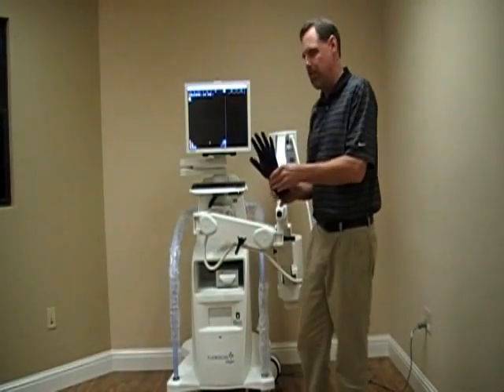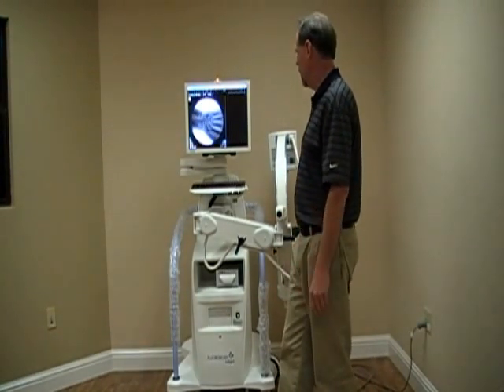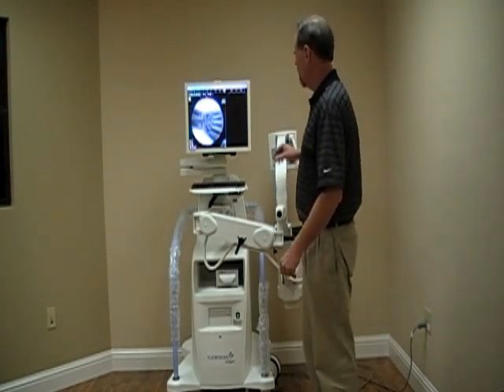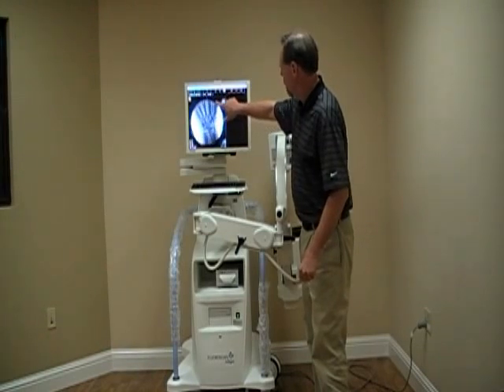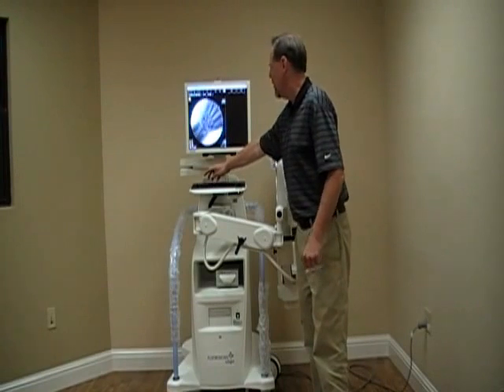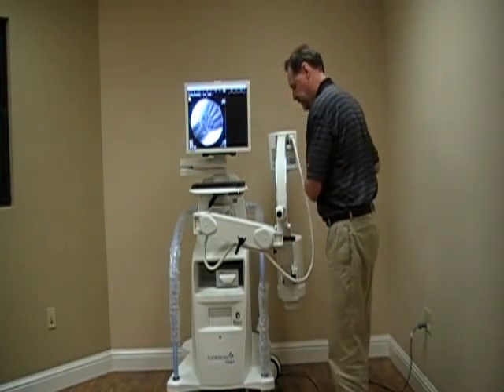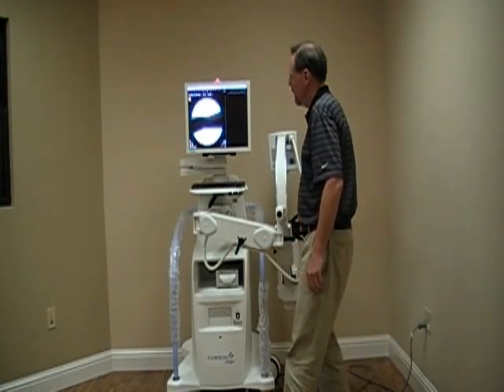We're going to take our body part, put it on the system, step on the orange pedal, and release the orange pedal. We can change the patient orientation on the screen, on the keyboard, and the physician can change that on the head as well.